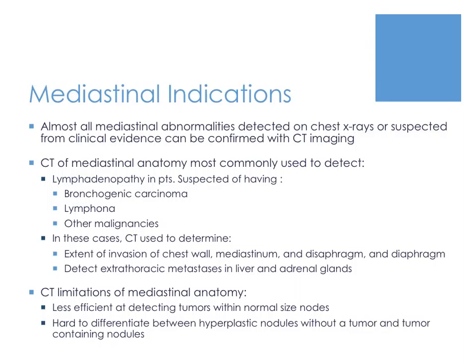CT as well as MRI does have some limitations. One of them is that they are less efficient at detecting tumors within normal size nodes or differentiating between enlarged hyperplastic nodules without a tumor and tumor-containing nodes.